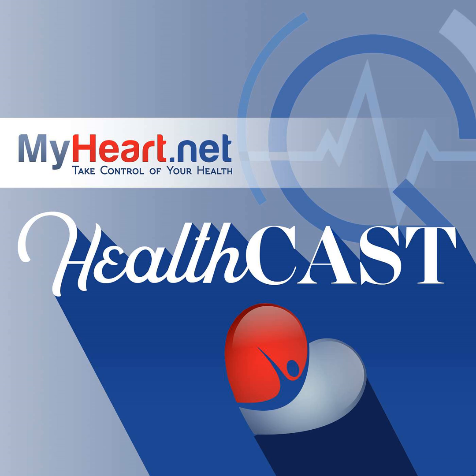Yes, sure. The calcium score is done with a CAT scan, or computed tomography, which is commonly used for CTs of the head, body, chest, etc. It's the same machine. We do not give any intravenous contrast. Most studies are EKG gated so that we can reduce motion-related artifacts.